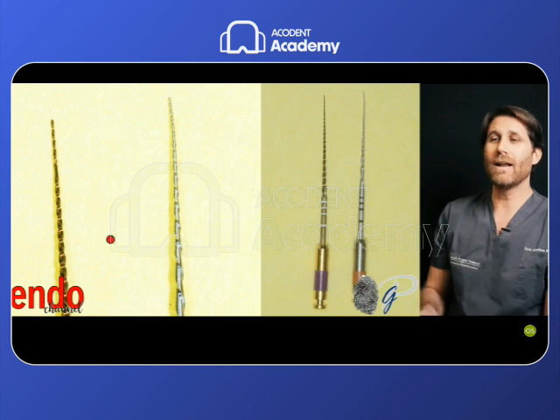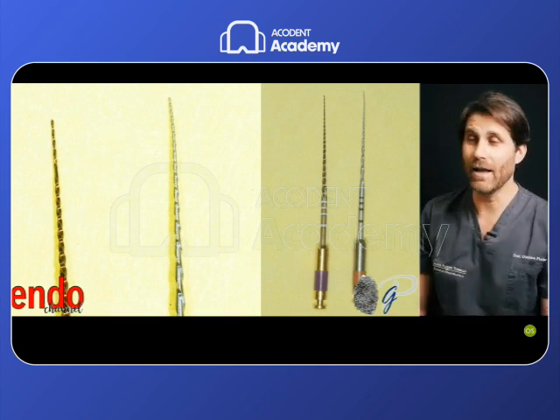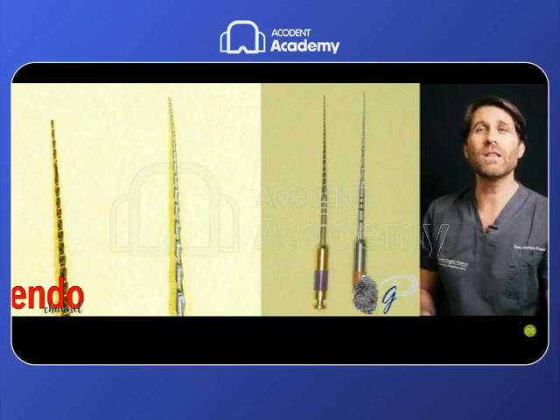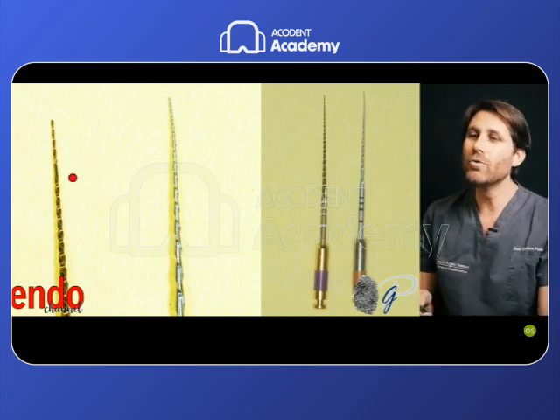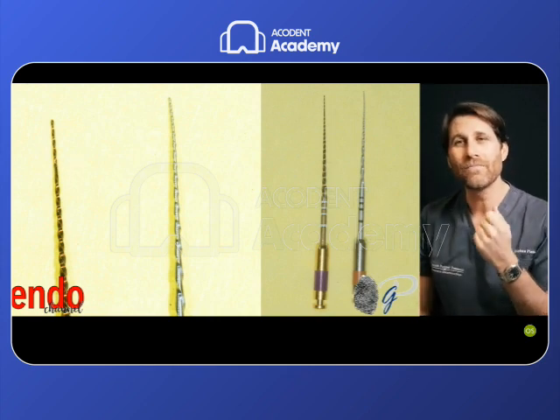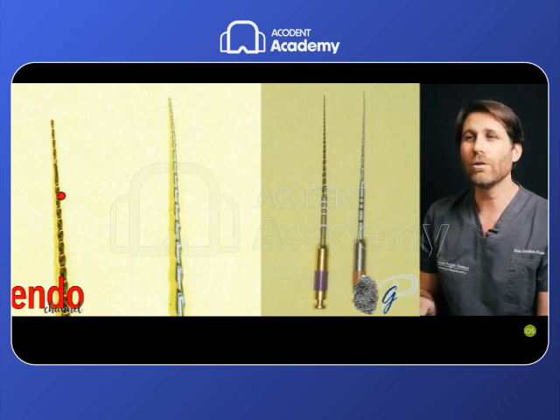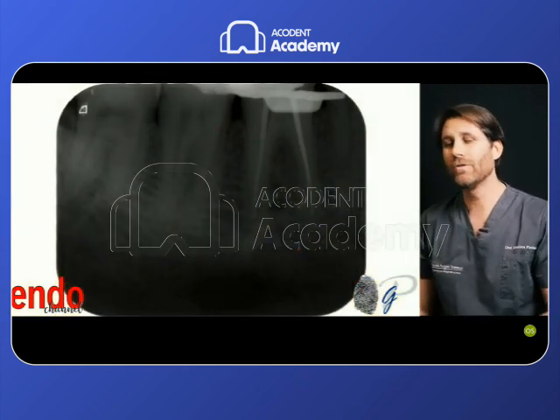In fact, the directions for use for these files are that you have to use them after scouting with the 10. You cannot scout an unscoutable root canal with them because the gold treatment increased so much the flexibility of the file, but reduced its torsional resistance. So in this case, we need more torsional resistance to withstand the torsional stresses in these procedures. And in fact, in this procedure, the Gold Glider distorted, while the Air Pilot reached the working length without any difficulties or effort.